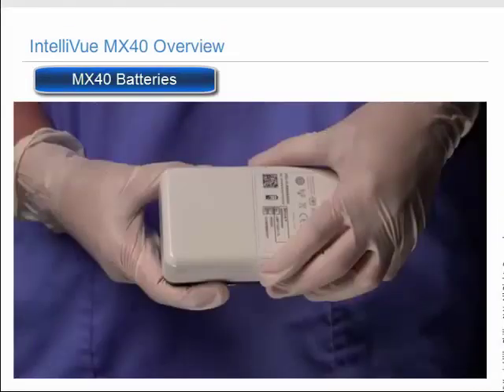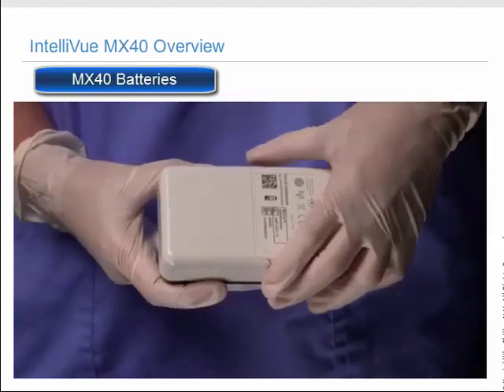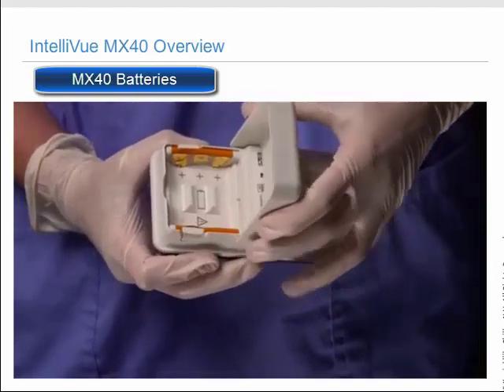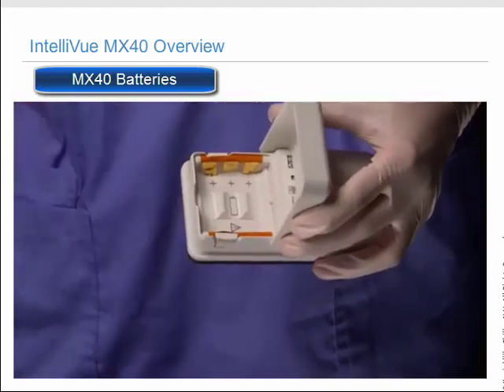To open the battery compartment, place the MX40 in your non-dominant hand, put your other hand on the black lines, squeeze and bring downward. If the door comes off, you have not broken it. Just attach it back to the MX40.